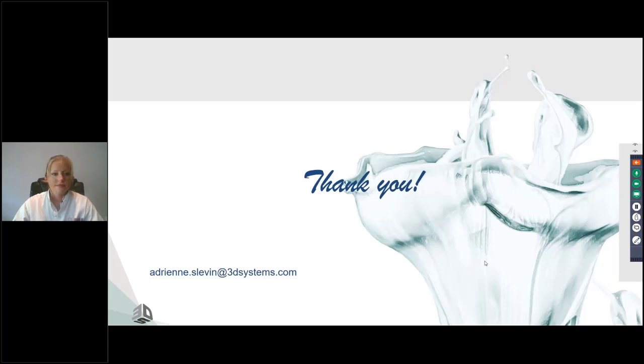Exocad is also on the line still. If you have any questions from earlier in the presentation, we're happy to answer those as well. Also, one indication that we didn't really get into during this presentation, which is definitely applicable to the clinical audience, is our Smile Creator and Smile Design module. Michael Conan provided us with a presentation this morning.